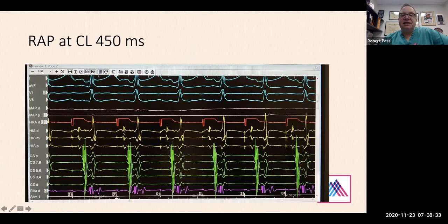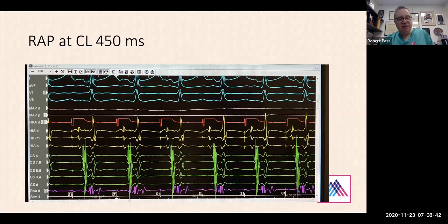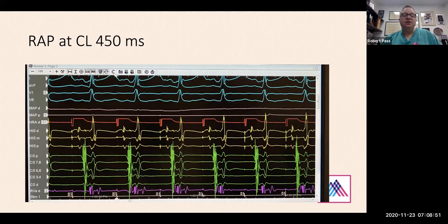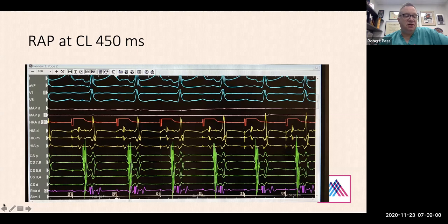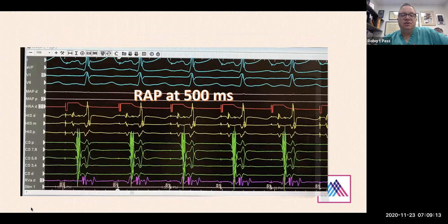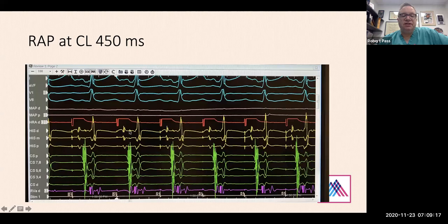Now at cycle length 450 — David, how would I know the heart rate? You take 60,000 divided by 450, which is a heart rate of 133. We're starting to see the PR interval lengthen. Looking at the AH interval from 570 to 450, the AH is getting a little longer. Interestingly, the time from stimulation to His is also getting longer, demonstrating decremental conduction in the atrial myocardium. As we get faster with rapid atrial pacing, we see a longer stimulation-to-atrial timing.